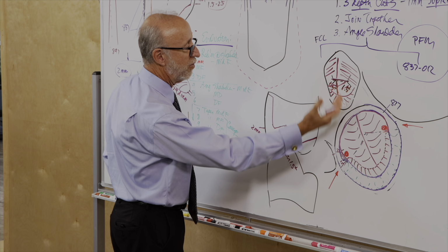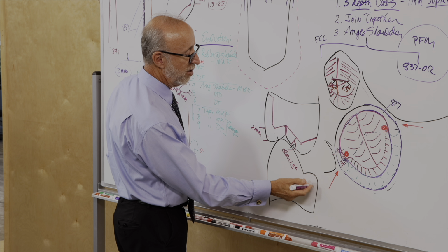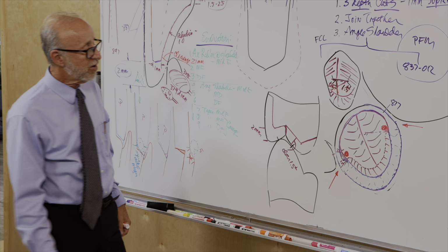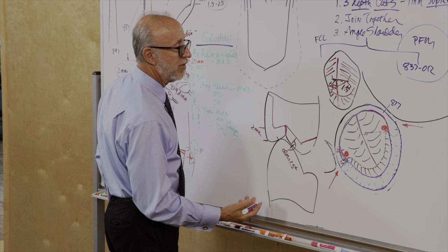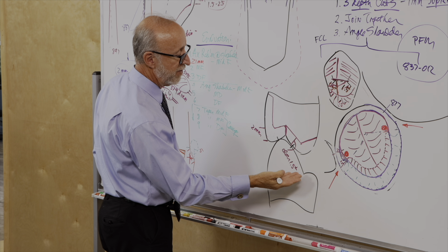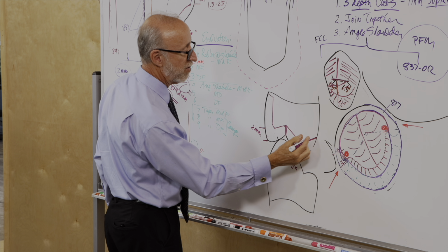Obviously, we're going to make it a full plane of reduction. Obviously, the clearance with respect to a lower first premolar doesn't mean anything at all, but the lower second premolar might be closer into occlusion on the distal side, so make sure we get the same 1.5 plus. But if there's no tooth in occlusion, make sure you reduce it. We've got to have metal and porcelain over that cusp.